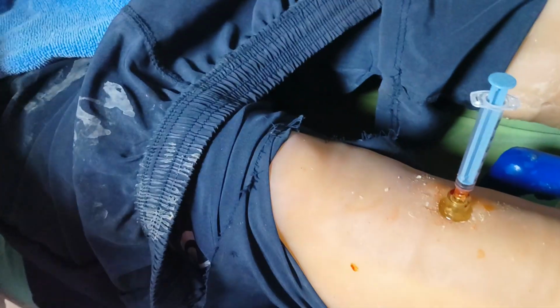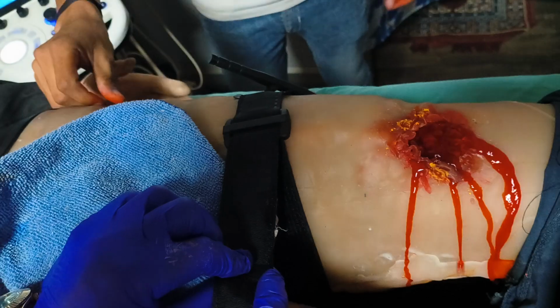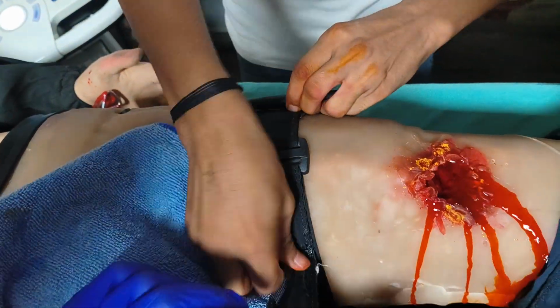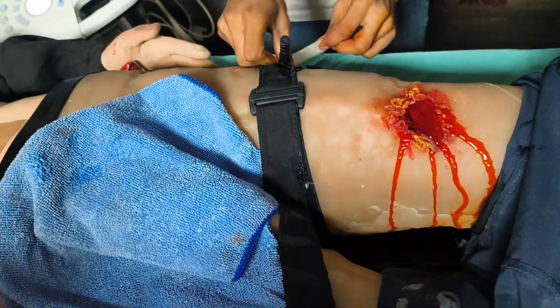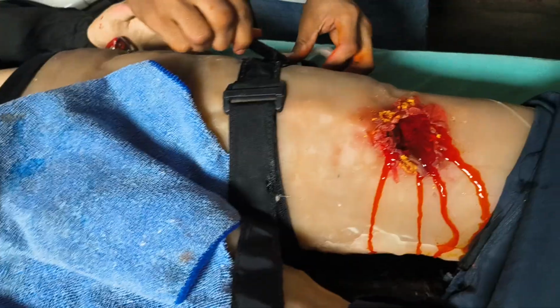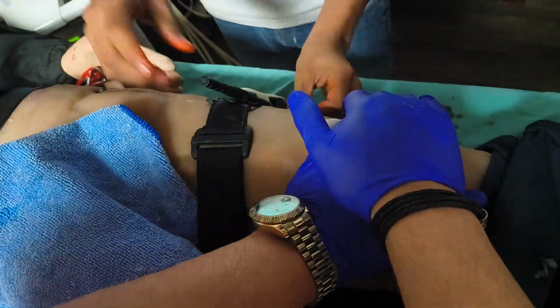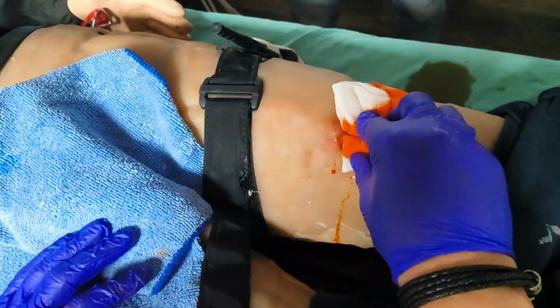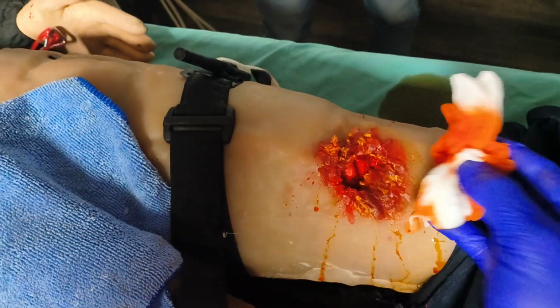Okay, now the next skill is how to apply a CAT tourniquet. So with this, to play first a catastrophic bleed, apply the tourniquet. So now it has stopped, or you can convert, if it doesn't stop, into a pressure bandage. Okay, after applying, you can apply the second tourniquet. So this was catastrophic, if you want to play that initially.